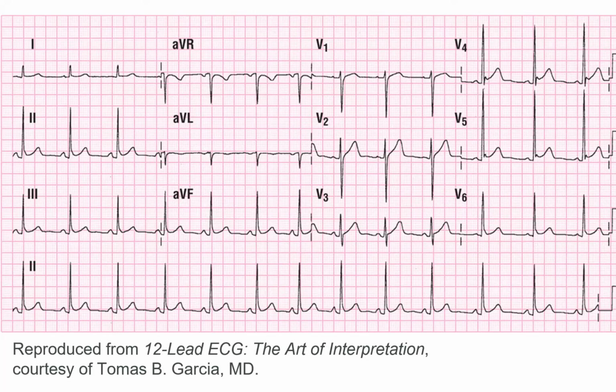Oh god, that's hard to see. 1 box, 2 boxes. That's kind of in your 3rd box, but it's not even 3 boxes wide. Here, we're starting right here. We're going to right here. See what I mean? Use that first one. It might be just in front of the purple there. Right there. Okay, cool. Yep. It's close. We're gonna use it as needed.